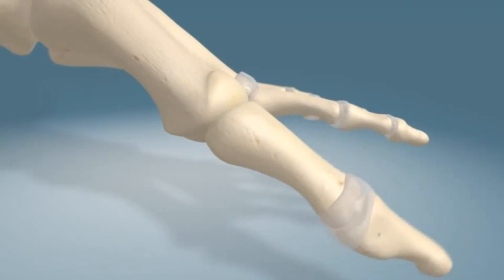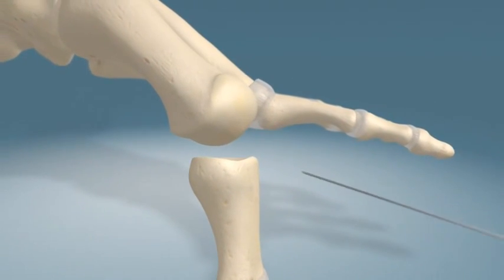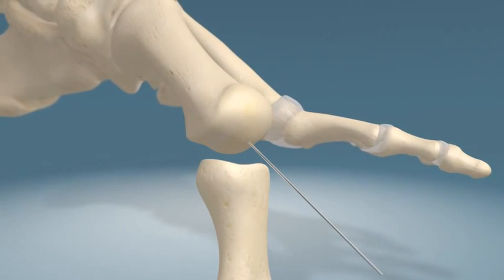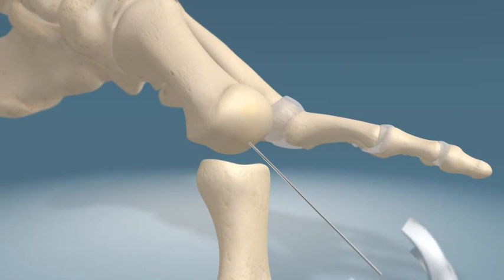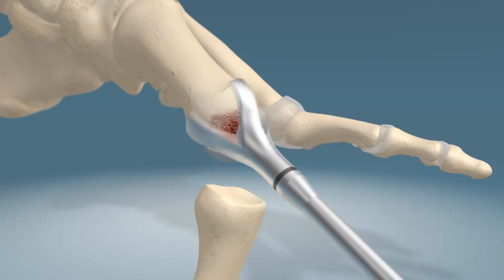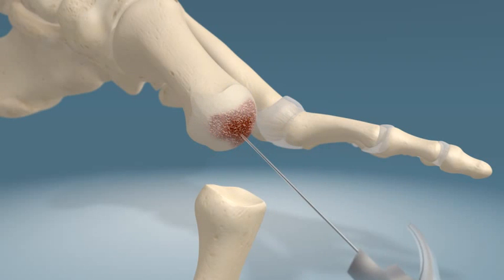A release of the soft tissue surrounding the joint is performed using routine surgical techniques. A 1.6 millimeter guide wire is drilled into the center of the first metatarsal head. A cannulated conical reamer is used to prepare the metatarsal head.